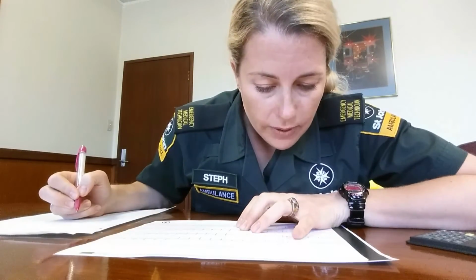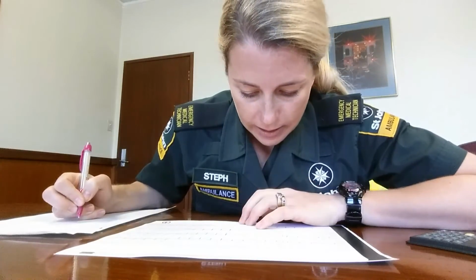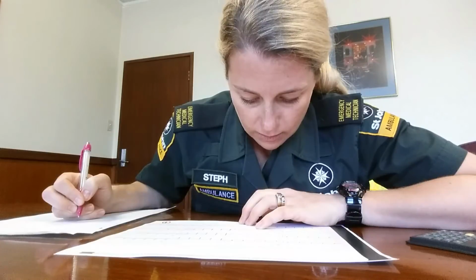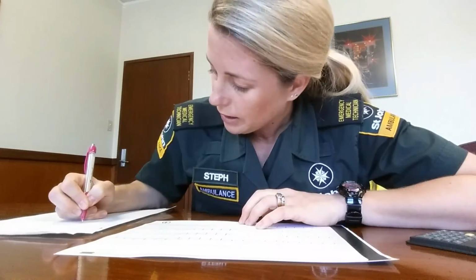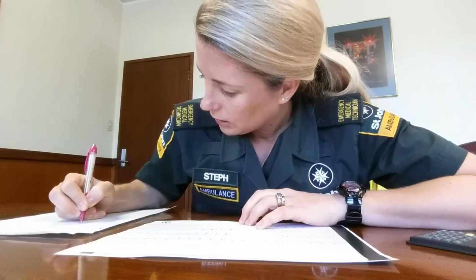1, 2, 3, 4, 5. So we've got 5 over to the right, and then AVF is, say, 5 minus 1, so 4. So 4 down because it's positive.